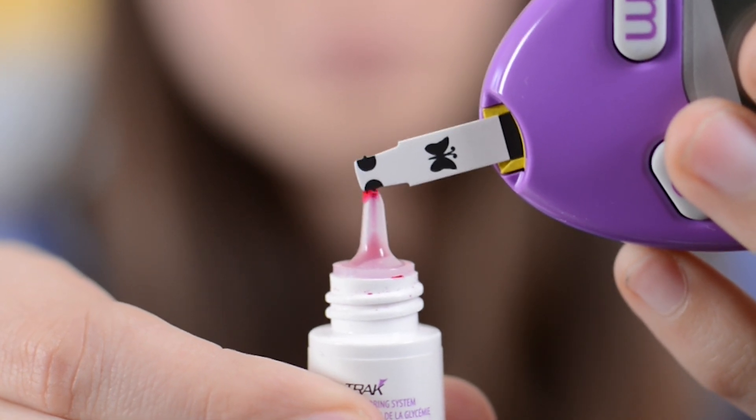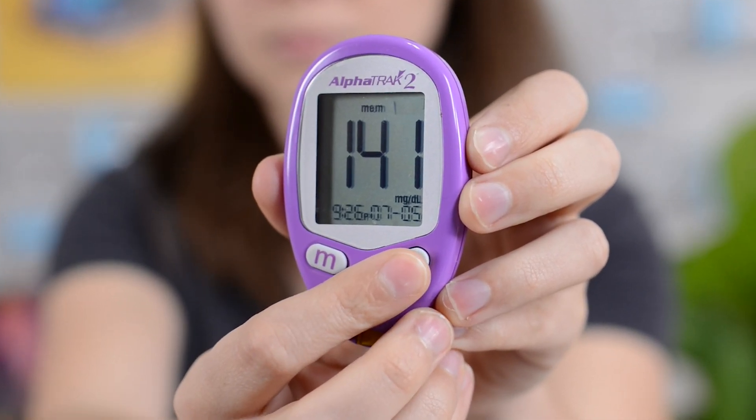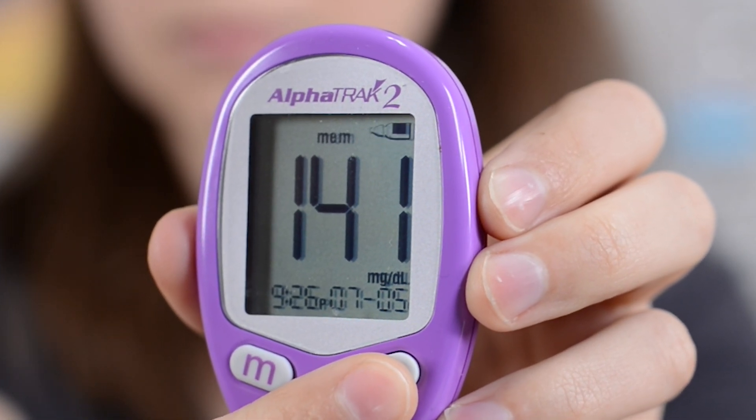Grab the control solution which helps detect if your test strips are functioning properly. You only need to test with it when you open a new bottle of strips or when it's been a long time since you opened that particular batch. After using the control solution, hold down the C button for two seconds — you'll see an icon indicating the device is set.